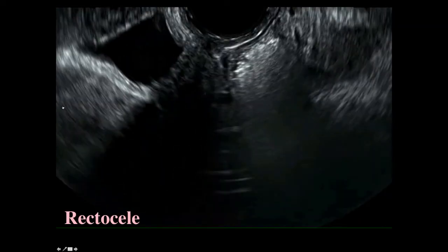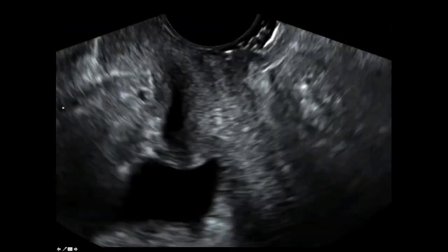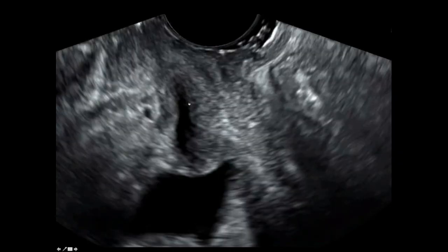So these are totally different kinds of problems. And there is yet one more type of problem. You might ask, what else can come down? Well, there's the bladder, there's the urethra, there's the rectum. And I was asked to look at this patient because the gynecologist knew that something was coming down, but couldn't tell what it was. So now we're going to run the tape.